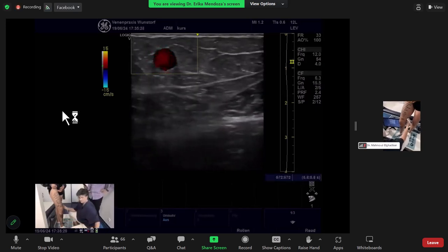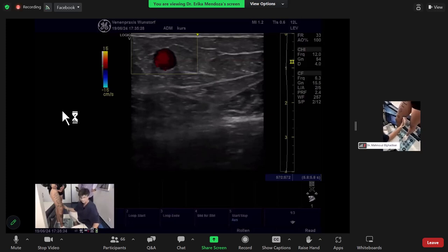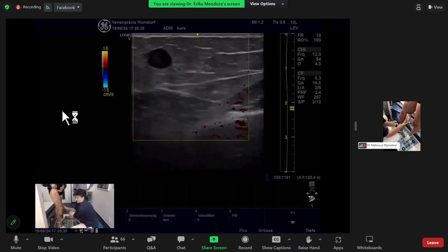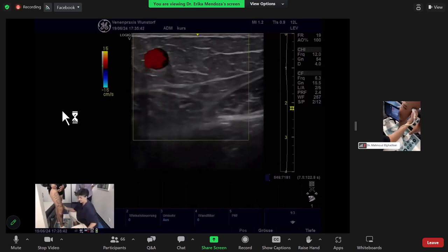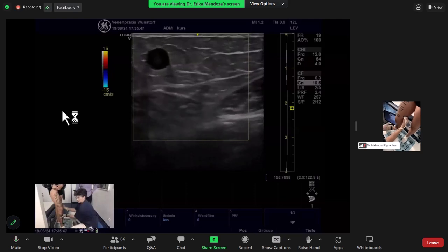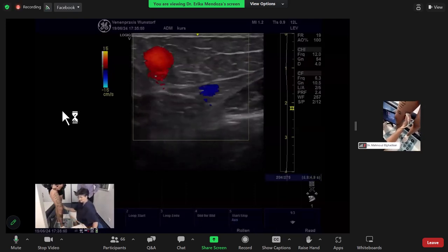And you see reflux in the tributary here, but we will make it bigger, okay, but not in the great saphenous vein. Yes, that's very nice, because you can see Professor Erica diagnose reflux by color, and this takes experience. You don't need to put the Doppler probe, but you can see the color, the upthrust and the reverse of color, and how long the duration is. So you can know reflux just by color.